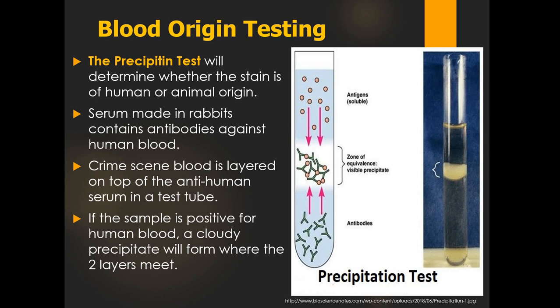We know about antibodies and antigens, right? Antigens are on the red blood cell, antibodies are in the plasma. And this is the human blood, and this is the rabbit serum on the bottom. Lovely. Okay, you okay to go forward, or you need a few minutes?